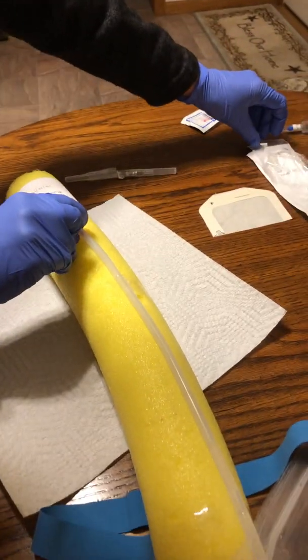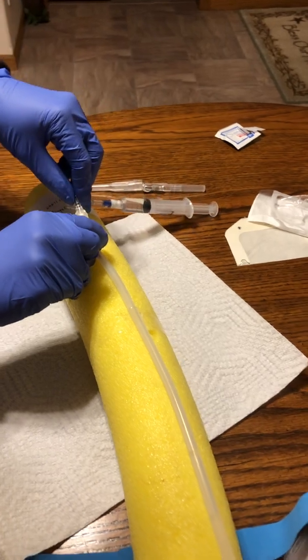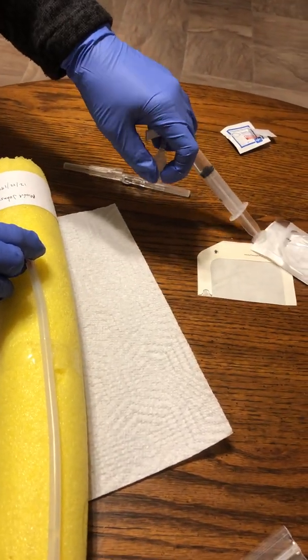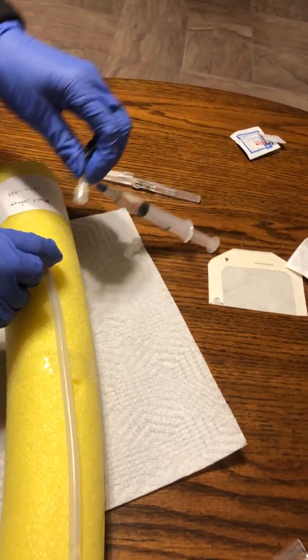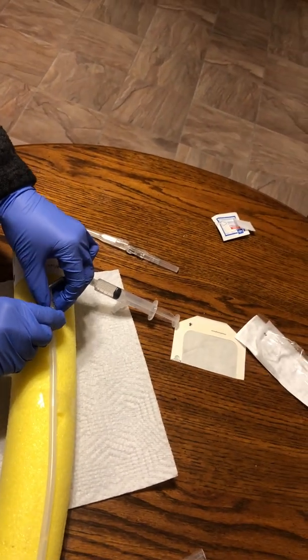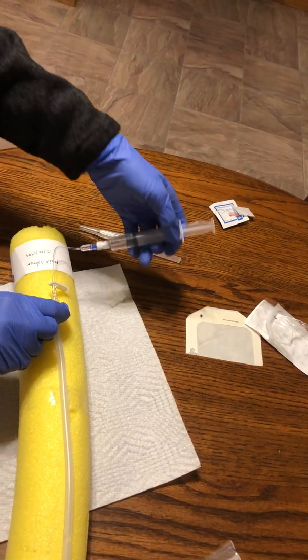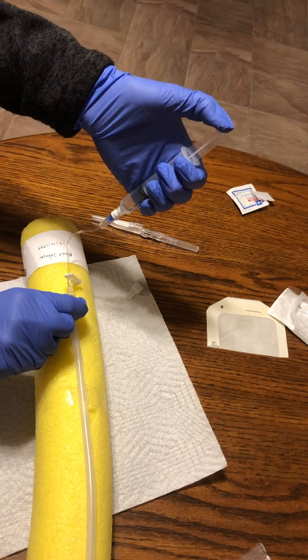Then I'm going to take my saline, and then I need to take off the cap, and using the sterile technique, I'm going to screw that on. Then I'm going to administer the saline.